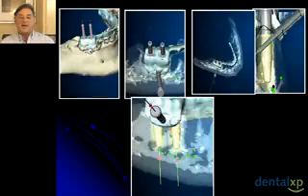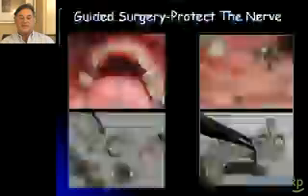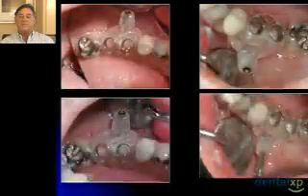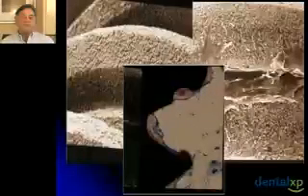He needed mandibular implants, so I certainly wanted to have the state-of-the-art treatment planning and restorations available for him. We wanted to have long implants, but we wanted to avoid the nerve. So in his case, we were able to create a partially edentulous surgical guide. We performed it in a flapless approach. The implants were positioned ideally. In his case, we went on. I'll perhaps skip through these.